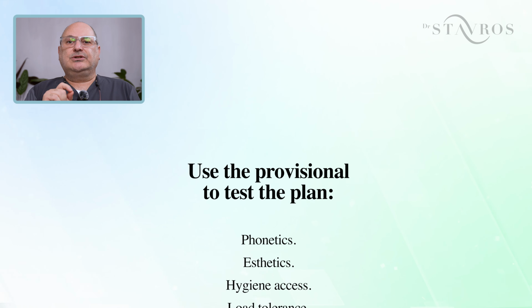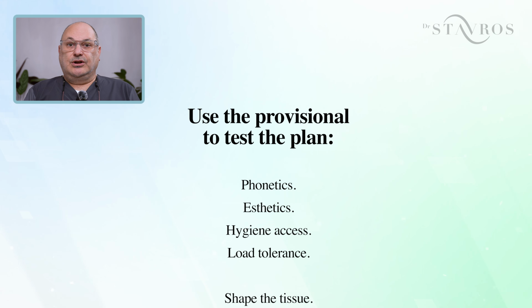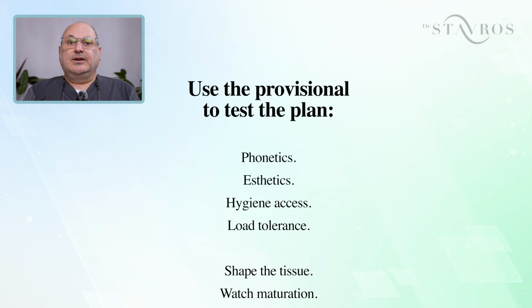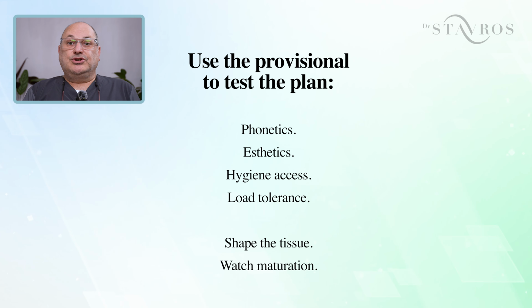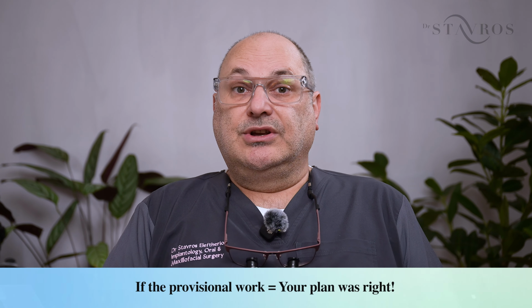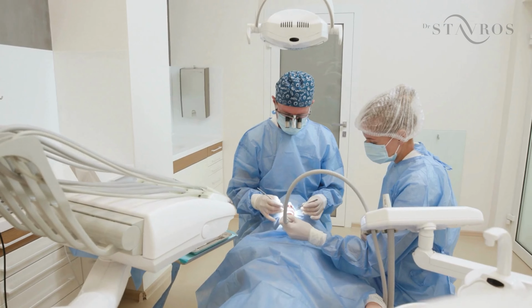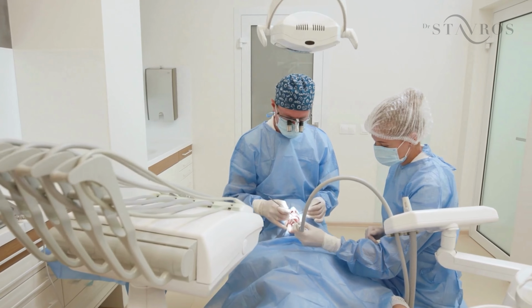Use a provisional to test the plan, the phonetics, the aesthetics, hygiene access, load tolerance, shape the tissue, watch the maturation of the soft tissue. And if the provisional works, your plan was right. If not, adjust now, not after the final teeth placement.